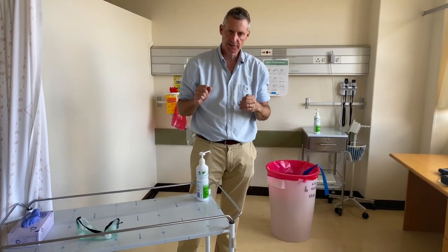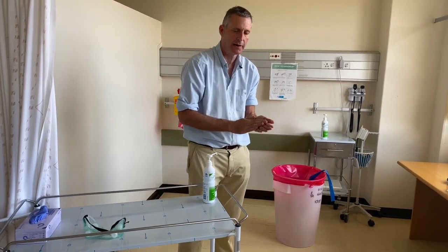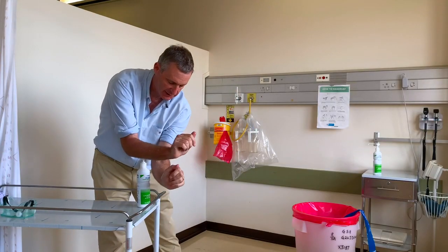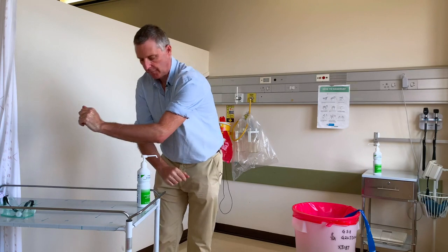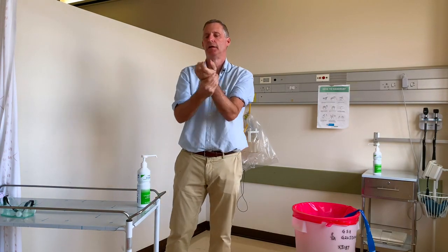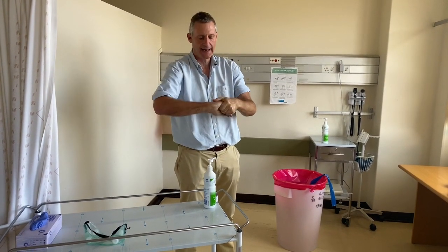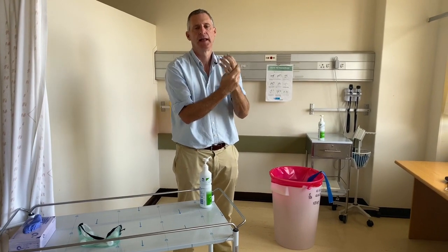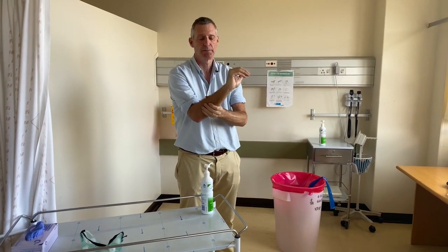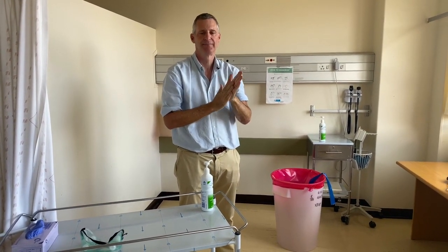At the end of the procedure it's critical to perform good hand hygiene. Because I've been wearing an apron and not a gown, I'm also going to ensure that my forearms, which have been exposed, also get some alcohol hand rub. And that is how to put on — don — and take off — doff — personal protective equipment, PPE, for the management of a patient with COVID-19. Thank you.